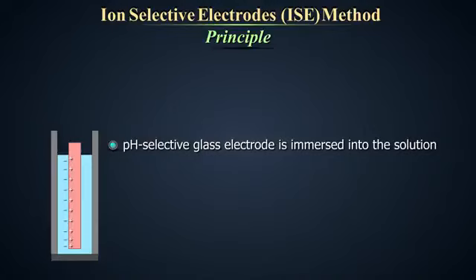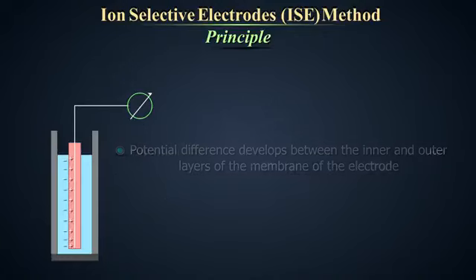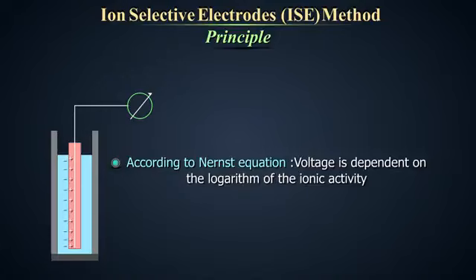When the ion-selective electrode is immersed into the solution, a potential difference develops between the inner and outer layers of the membrane of the electrode, which is related to the ionic concentrations of the solution. The voltage is theoretically dependent on the logarithm of ionic activity, according to the Nernst equation.